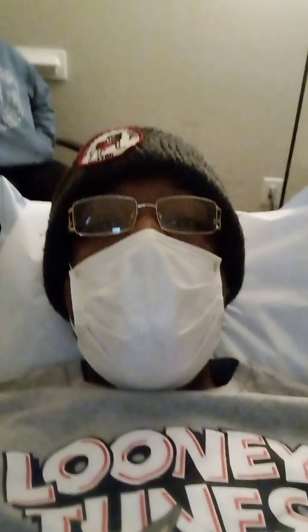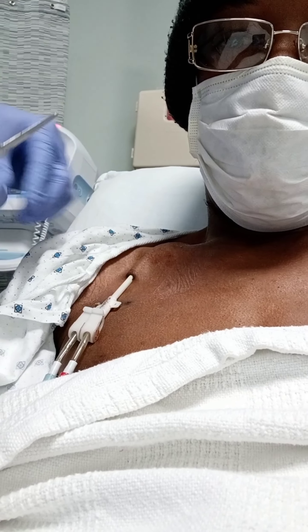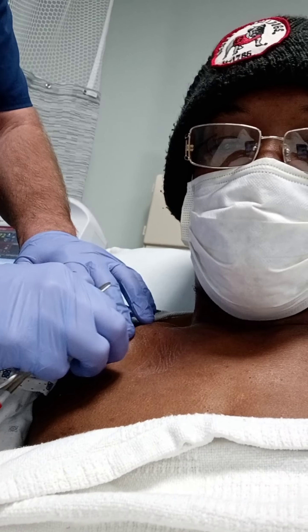I'm not getting the ultrasound, not yet. Oh, that just happened — a little pinch, it's gone. Is it hurt up here at all? Tender. Good.